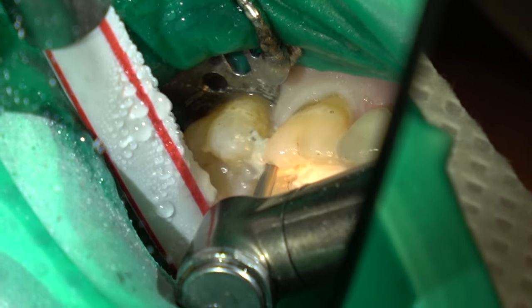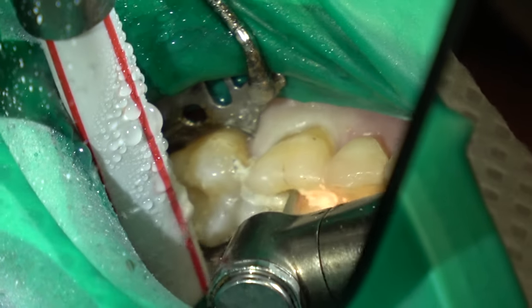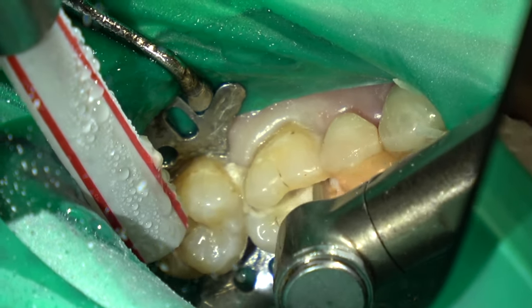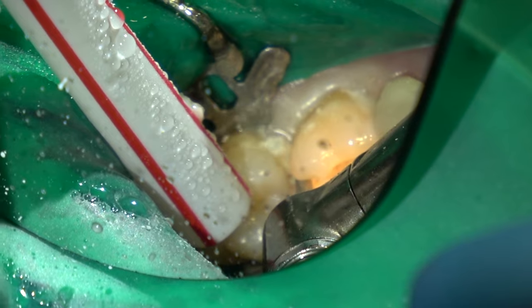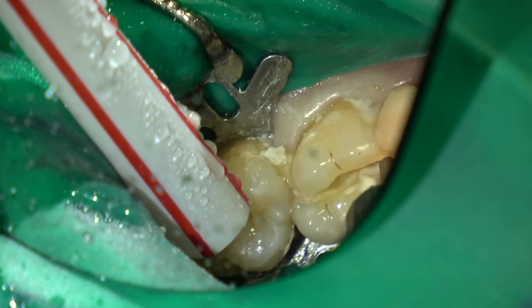The preserved socket will form a little cup for my platelet-rich fibrin graft, so the bone will grow and reform, and I'll have a nice receptor area for my implant in about six months. With molar teeth, I let the graft heal for six months — some people let it heal for three months, but I let it heal for three to six months before placing the implant.